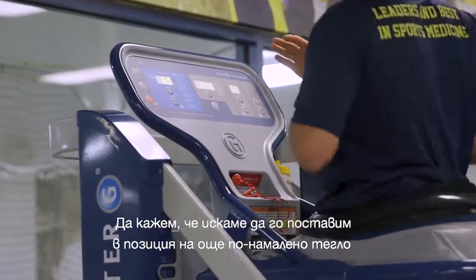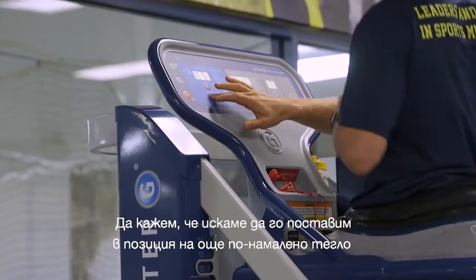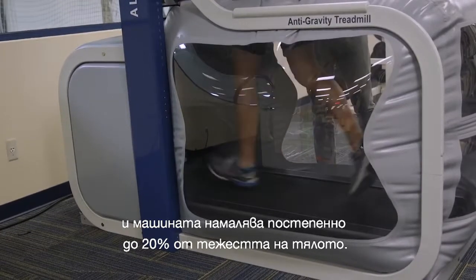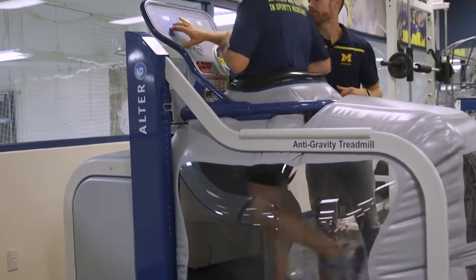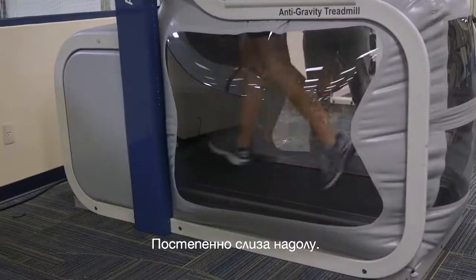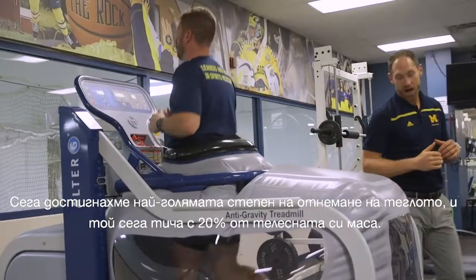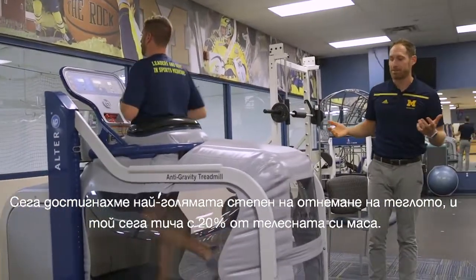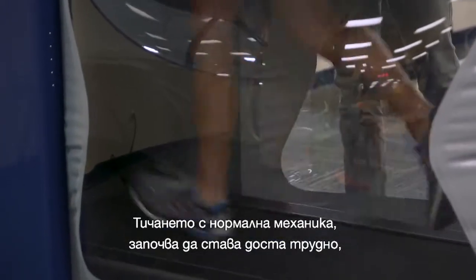Let's say we wanted to take him to an even more unweighted position. The machine goes all the way down — I'm going to take him all the way down to 20% of body weight, incrementally. So now we're as unweighted as we can be with this machine. He is now running at 20% of his body weight, and at that point it is going to be pretty challenging to run with normal mechanics because you are so elevated.